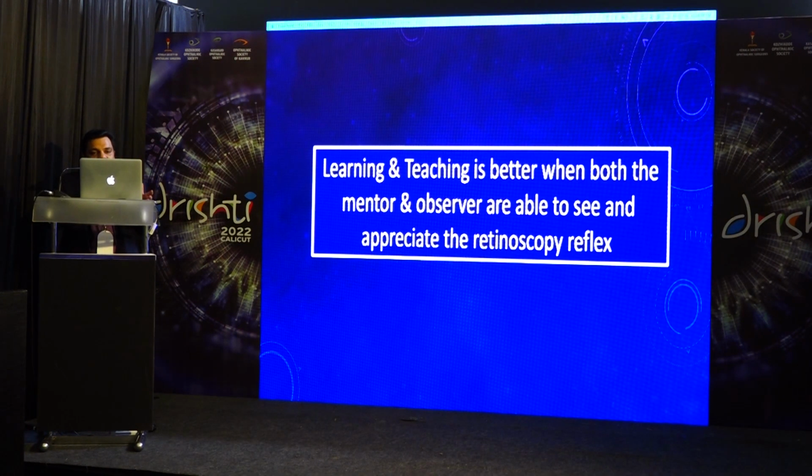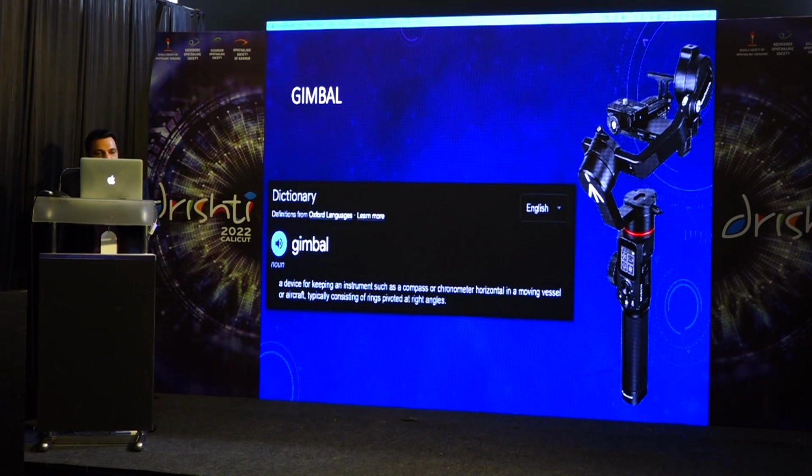So learning and teaching is better when both the mentor and observer are able to see and appreciate the retinoscopic reflex. So we describe this technique, the gimbal scope. So what is a gimbal? It's any device for keeping an instrument such as a compass horizontal in a moving vessel or aircraft. So that was the word gimbal which we got from, and it's commercially available on Amazon, for basically imaging cameras or even smartphones.